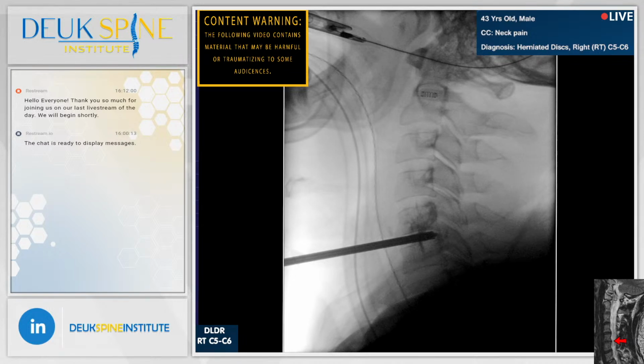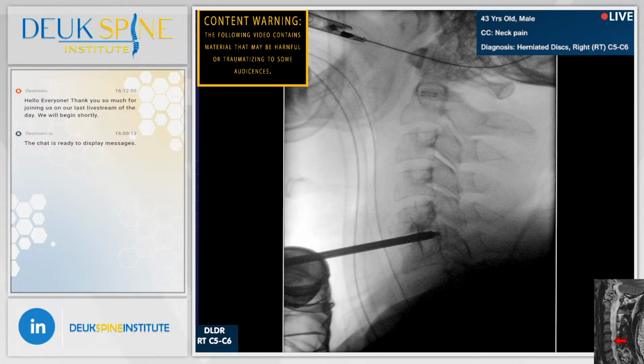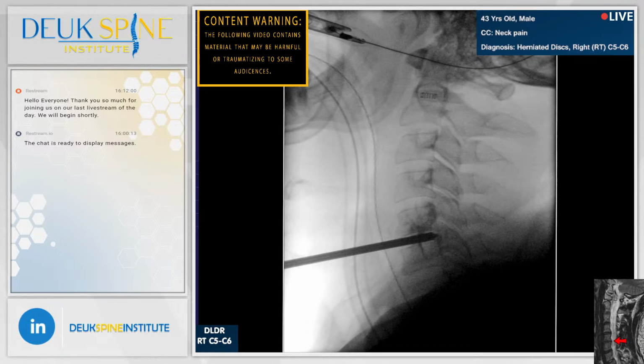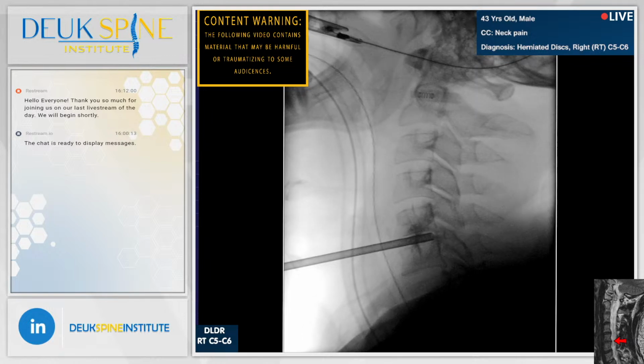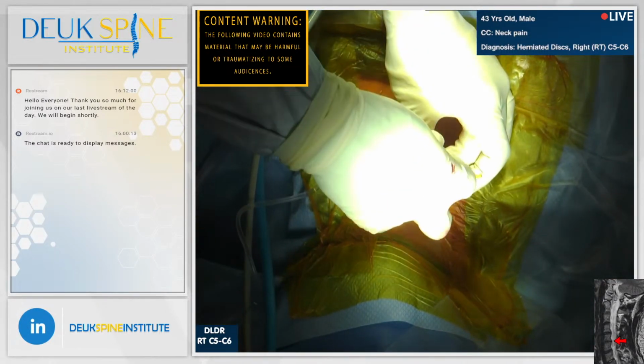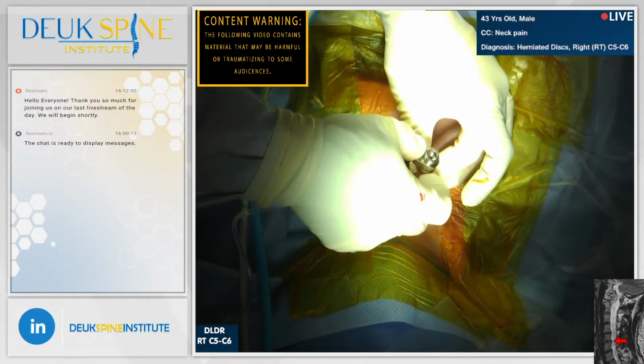So why did this patient come all the way from California? The answer is, simply put, they don't do this surgery in California. They haven't figured out how to do endoscopic spine surgery. What they're offering patients are fusions and artificial discs. And that's what I used to do for 20 years. I've done a lot of fusions and artificial discs. I think that's good. I'm happy with that. We're going to take everything out, leave the tube, and do the whole surgery through it. As a matter of fact, I've done 1,000 cervical fusions in my career. I've pretty much stopped doing them, but I used to do them every week for many, many years.